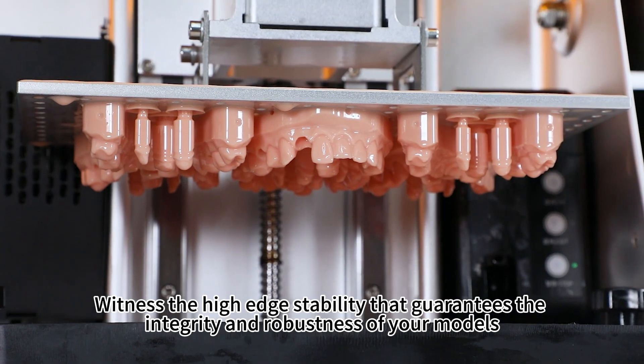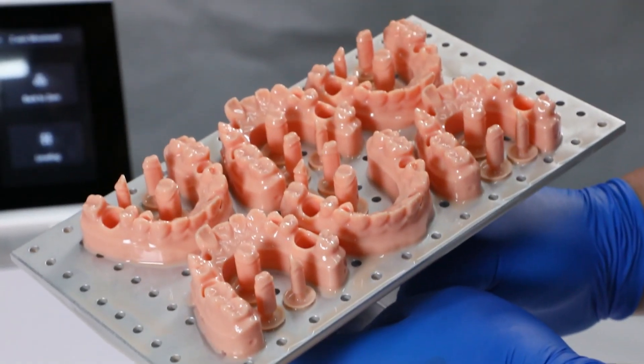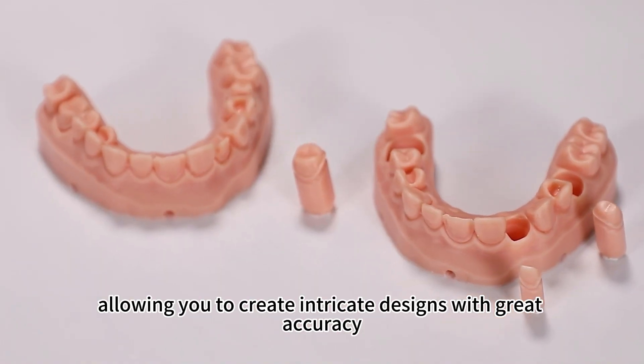Witness the high edge stability that guarantees the integrity and robustness of your models, making them resistant to external pressure and impact. Our removable die model resin ensures high forming precision, allowing you to create intricate designs with great accuracy.